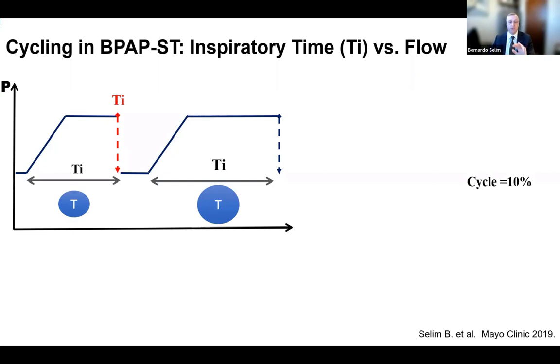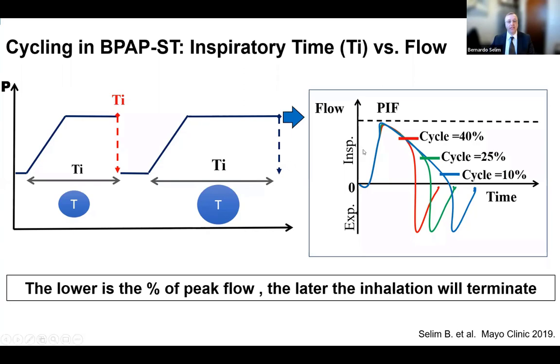Now, let's pause here, look at me for a second, and I'm going to explain to you what flow is. So let's take a breath. You see that at the end of my inhalation, my flow goes down. So the question with the flow settings is, at what time do you want to cut off that inhalation? Do you want to cut off the inhalation pretty early? And then you have numbers that you can fall up to 40%. That means that you cut it off pretty early, the inhalation.